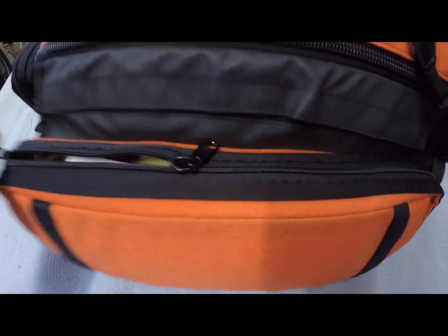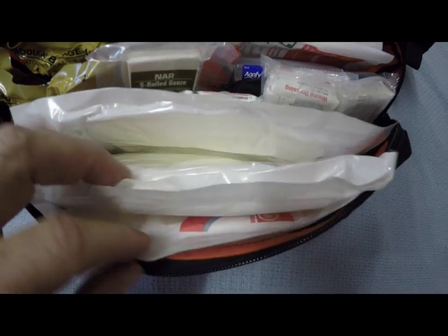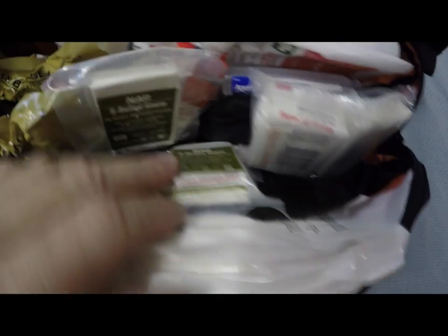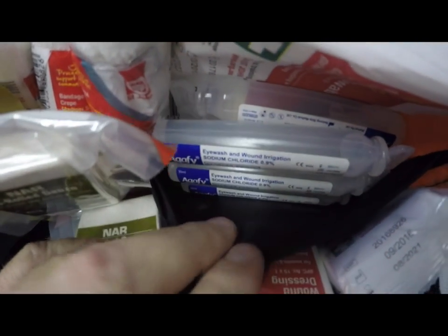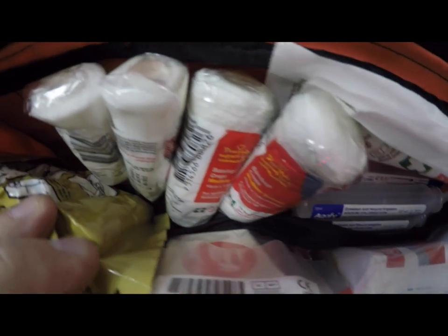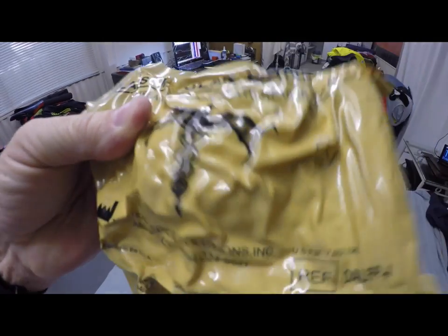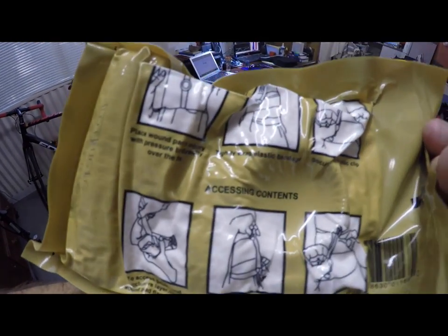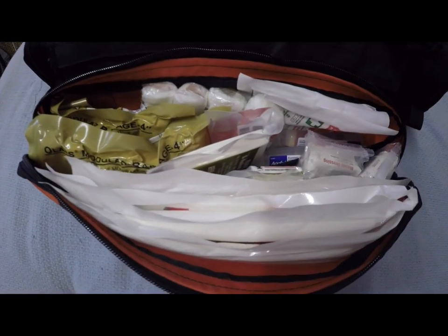Bleeding is such an important thing with major and minor trauma. The right pocket is also filled with more goodies. In here we've got some combine dressings — about four of them — which are very important. We've got more compressed gauze, some wound dressings — two of them — saline for irrigation, some 4x4s for cleaning the wound, and some gauze rolls. Finally, we have two of my favorite dressings: Olaes modular dressings. These are amazing — every trauma pack should have one or a couple of these.